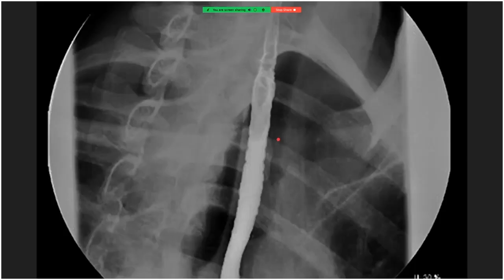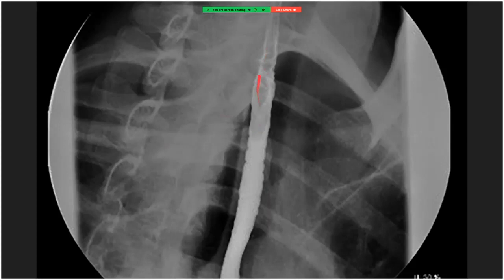This double contrast esophagram shows contrast lining the esophageal mucosa. Compared to surrounding structures, the esophagus is less distended than normal, and there are concentric rings of contraction in the middle to upper esophagus. This is the typical appearance of eosinophilic esophagitis.